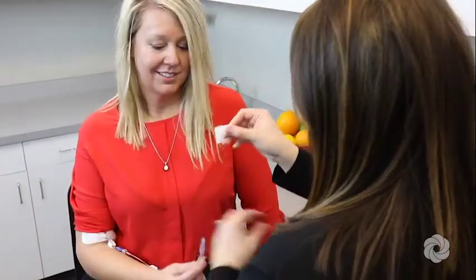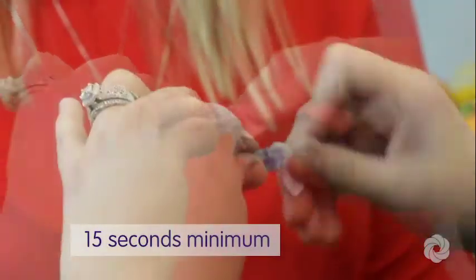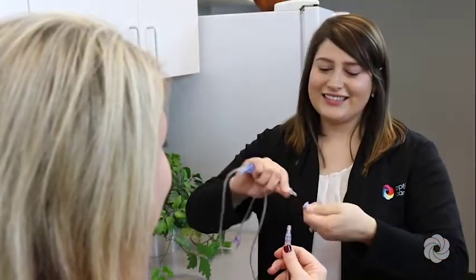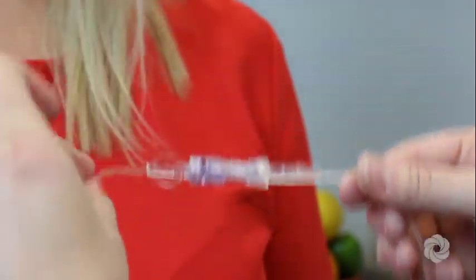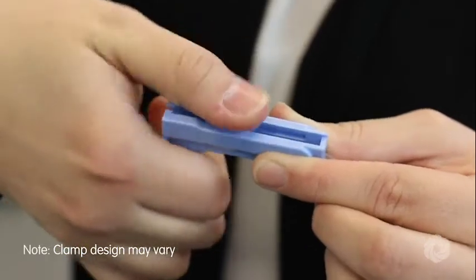Scrub the needleless connector on your IV catheter for at least 15 seconds and allow to air dry. Remove the protective cap from the IV tubing. Attach the IV tubing firmly to the needleless connector on your IV catheter. Open all clamps on the IV tubing.